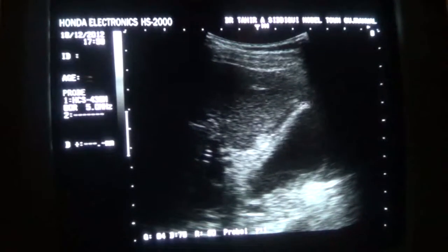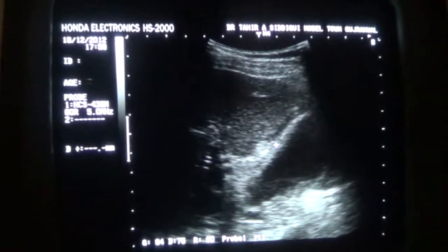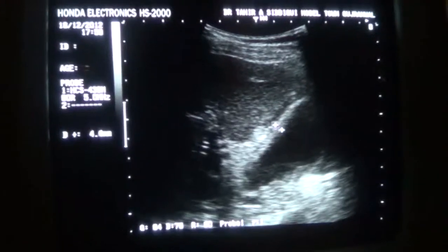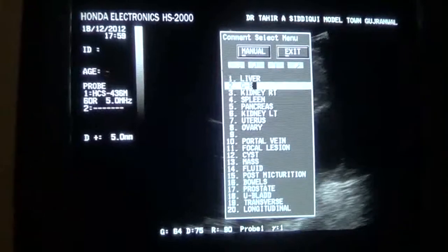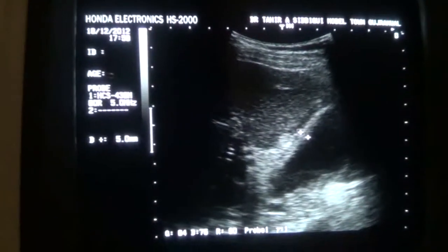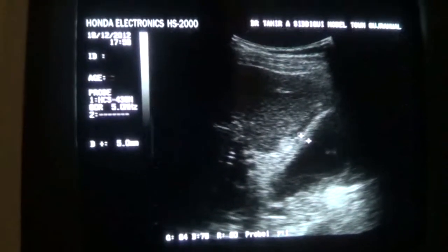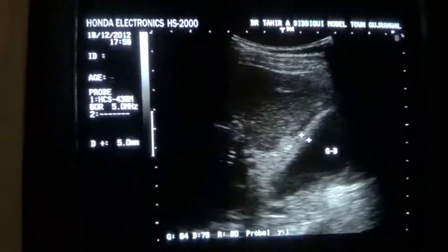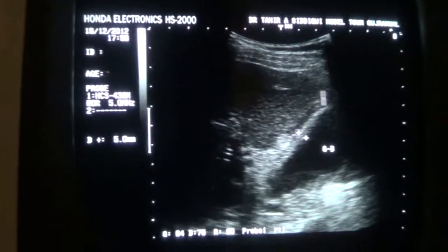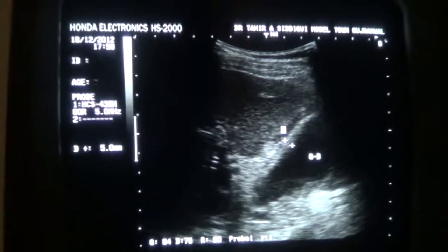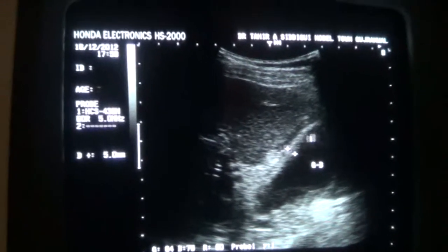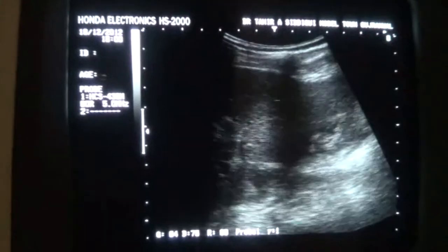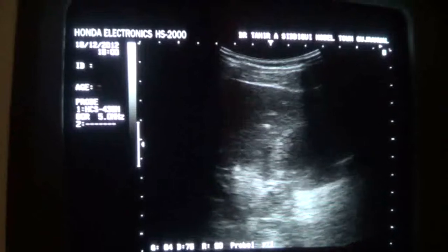You see this is the anterior wall of the gallbladder, here it is approximately 5mm — anything more than 4mm is pathological. This is the gallbladder and this is the fluid surrounding the anterior wall as well as the fundal region of the gallbladder. So this is pericholecystitis.